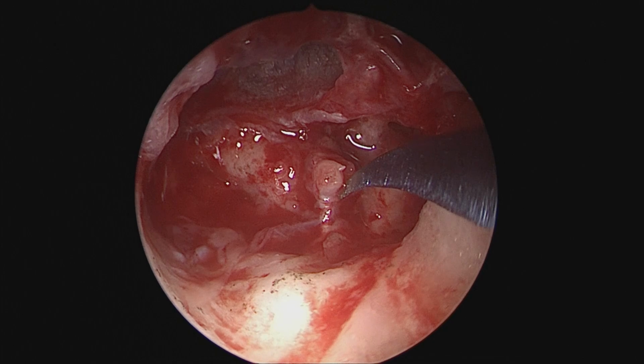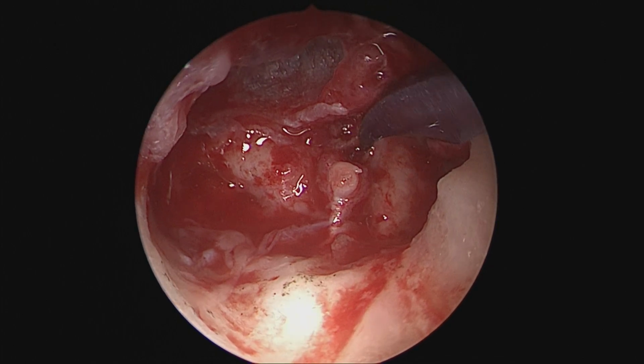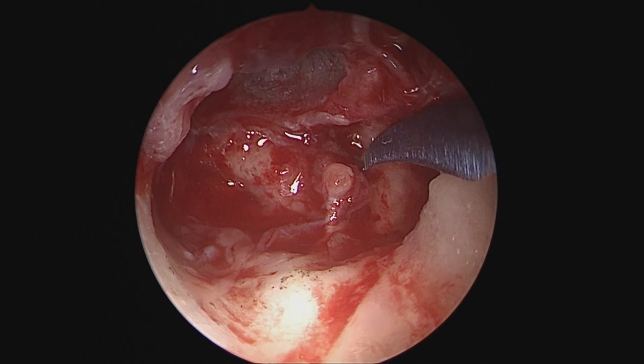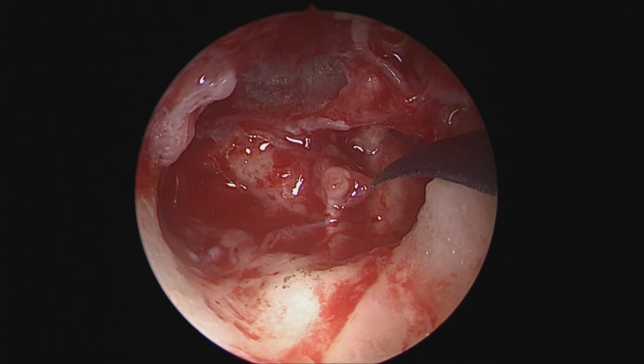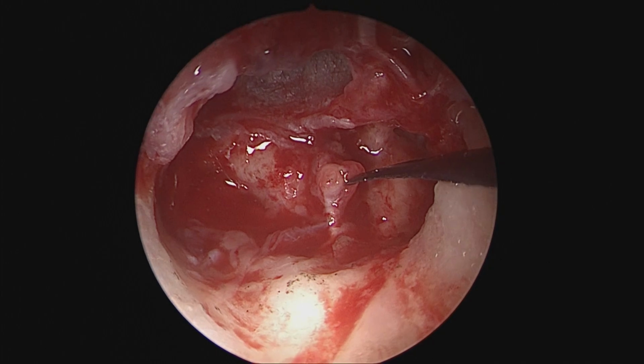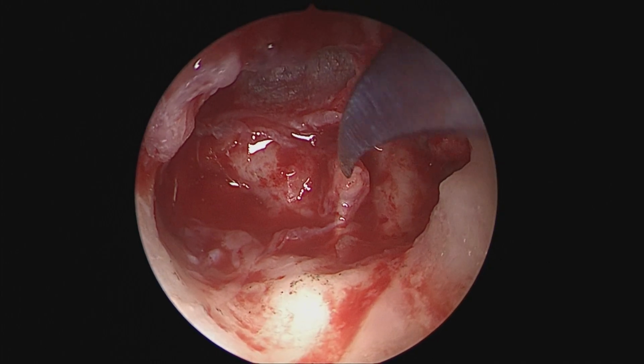And what seems to be reassuring is that as of now, we do not see any squamous epithelium in the middle ear. We can see the fallopian canal that is intact, and a little bit of excess diseased mucosa from the stapes being cleared, to whatever extent it can be safely cleared.